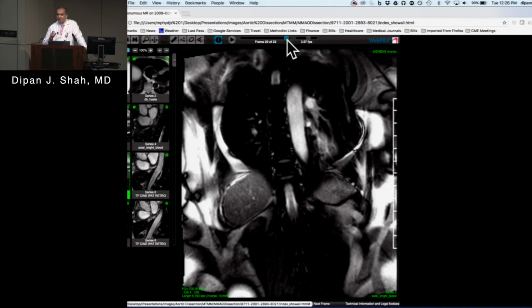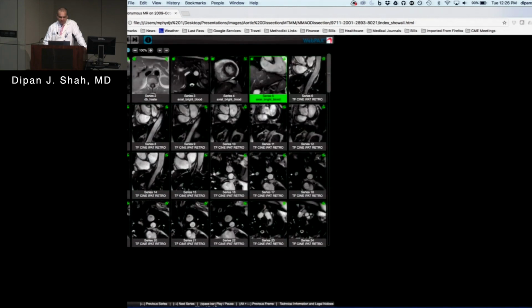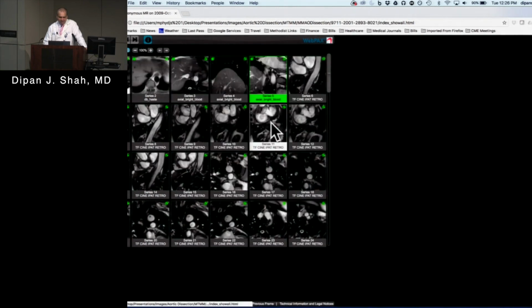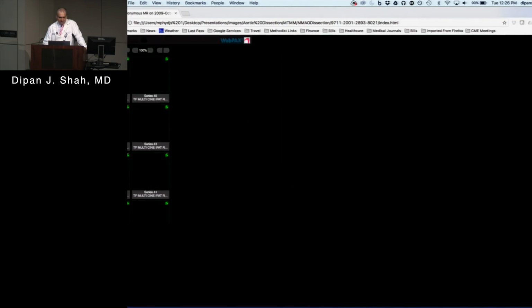Little's tuned into is the fact that if I try to put all this together, could this actually be emboli that's doing this, in which case it would be an emboli that's caused a pulmonary embolism as well as crossed a PFO, and then now this is actually a thrombus that I'm seeing. And so this actually is a case where, again, if we do a full set of dynamic images, oftentimes things can be a little bit more clear.